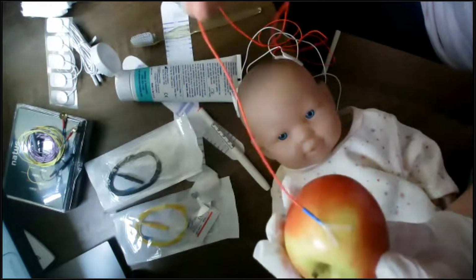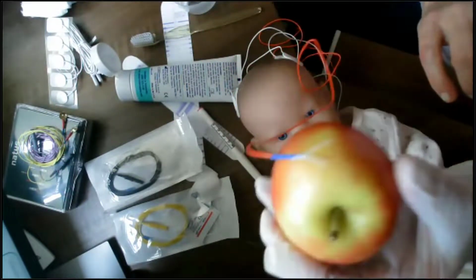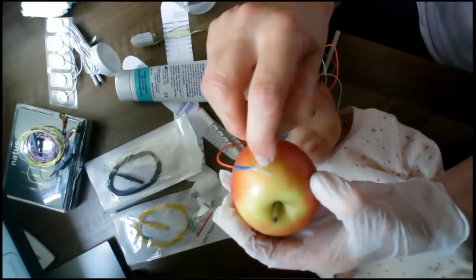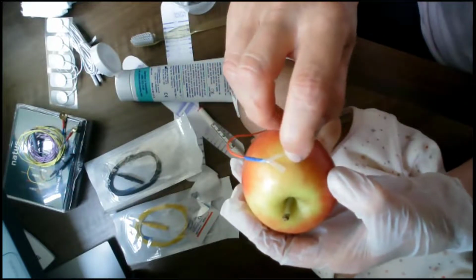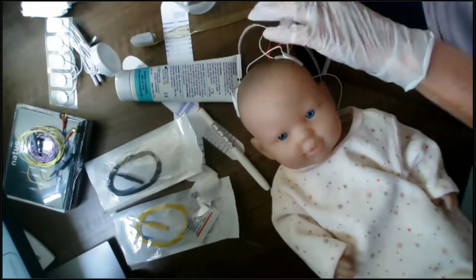And that's quite significant pulling from my end. And you can see that that needle is quite well secured in there. And I can see it's beautifully just underneath the skin. So I'll do that to all 4 electrode sites.